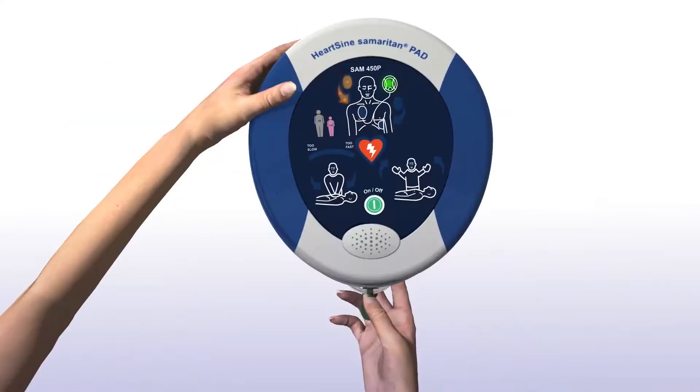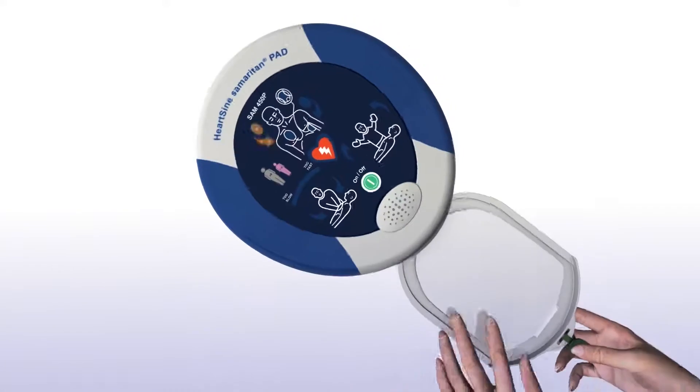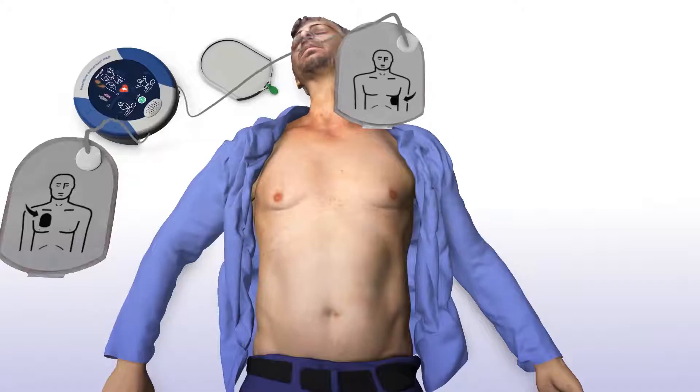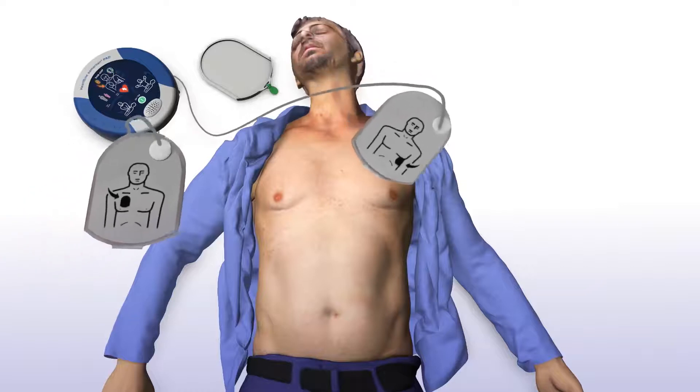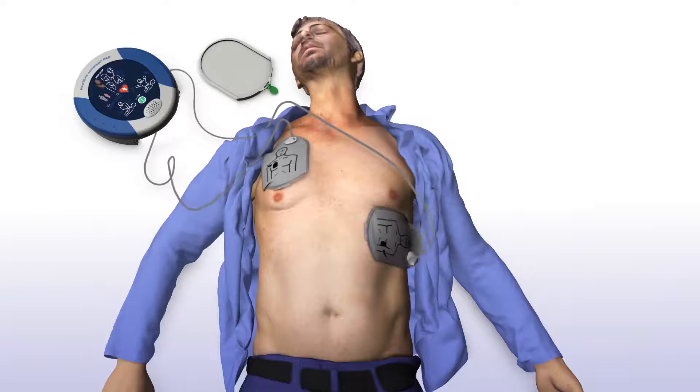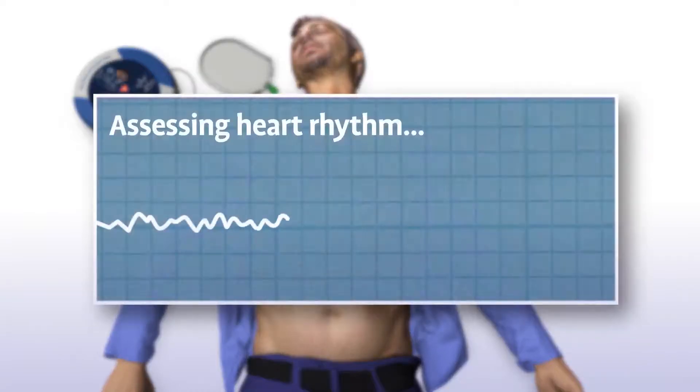Pull the green tab to remove pads. Peel pads from liner. Apply pads to the patient's bare chest as shown in the picture, and press pads firmly to the patient's bare skin.